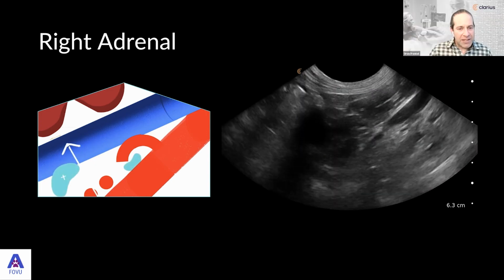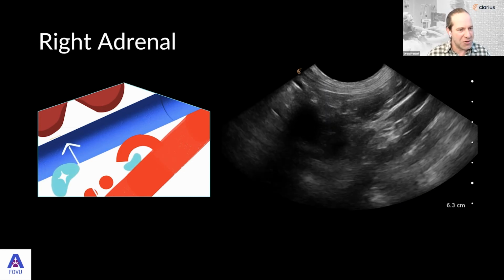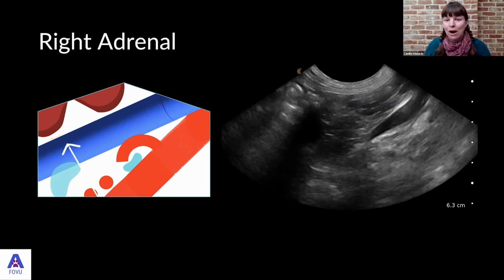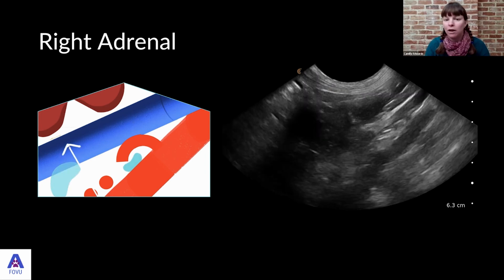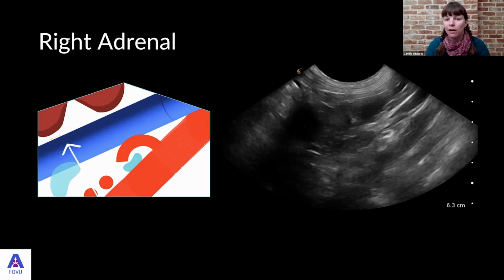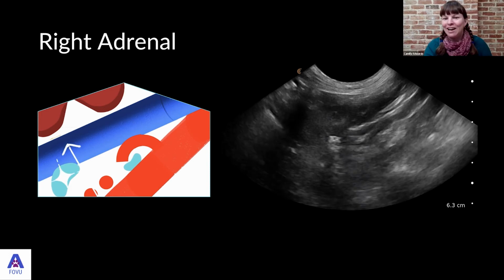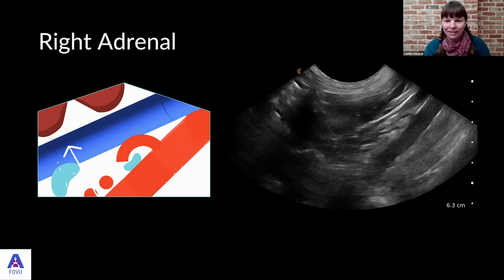With these tiny organs, it really emphasizes how much you need to practice, right? To even know that you're seeing the adrenal gland. It's a pretty challenging scan. It is very challenging, and it's all about practice. It's about repeating it again and again, knowing your landmarks as well. That's the key, really knowing your landmarks, knowing you're looking in the right area, and particularly, if there is a big pathology, it usually stands out a bit more. So that's the good thing with ultrasound, that it's often more obvious when it's gone wrong. This is a healthy dog.